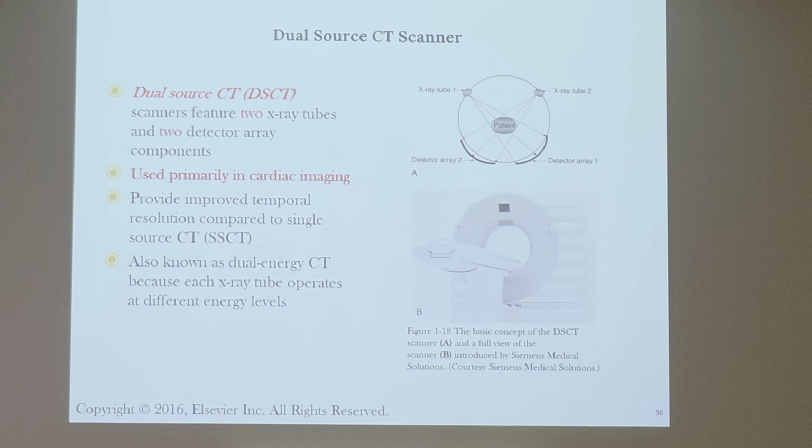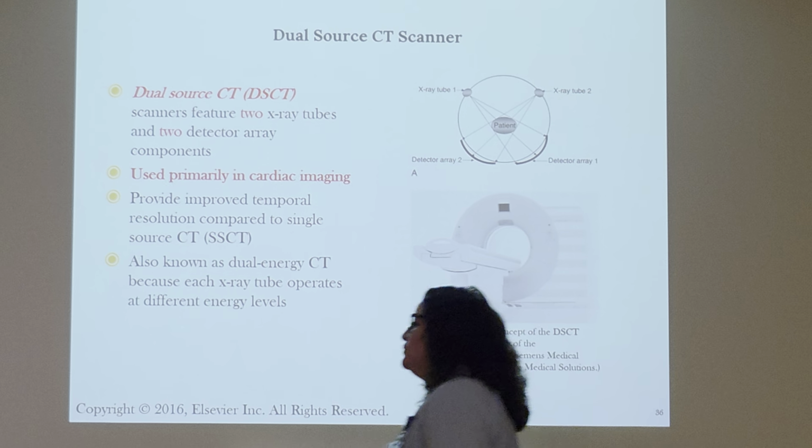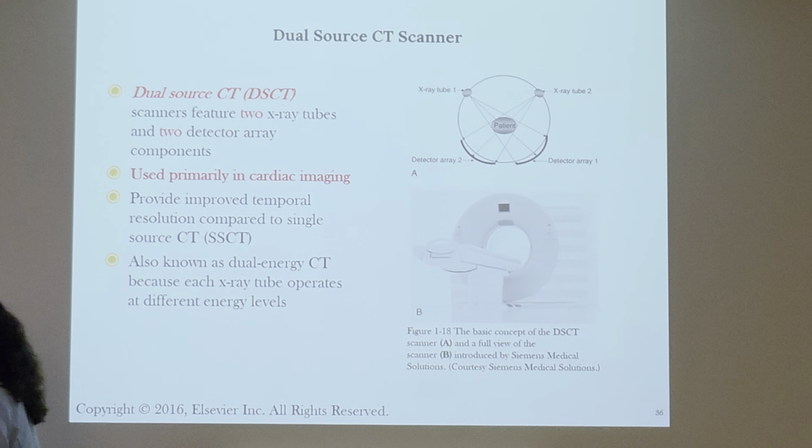Go home early. We're not generating any revenue. We're going to save costs and budget. You're like, but I've got to work. It's a ripple effect. So this dual source is going to be basically speed.